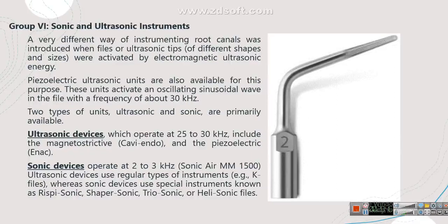Usually we need to do vibration, so some ultrasonic instruments could help us to vibrate the irrigation solution in that specific area, respecting the working length when we insert the tip of the instrument within the canal system. Sometimes the ultrasonics could help us to remove the debris as well, and also open the canal system when a pulp stone exists. So it's quite important to know how to use this kind of instrument and tools during endodontic therapy.